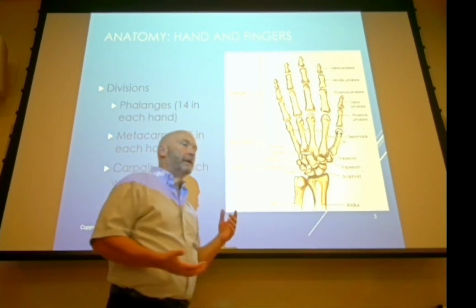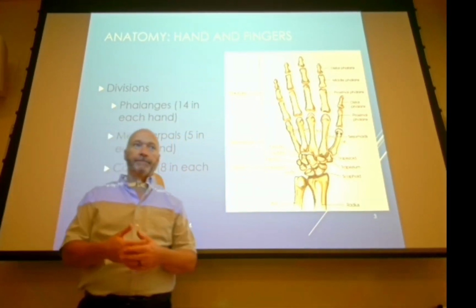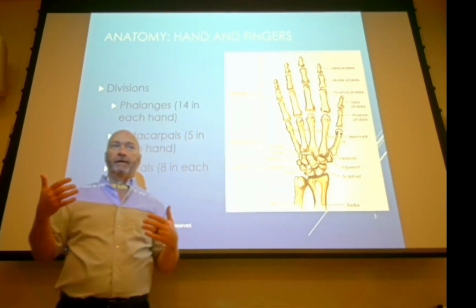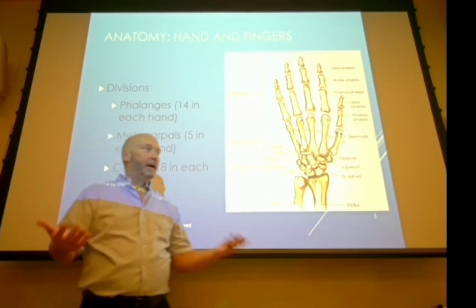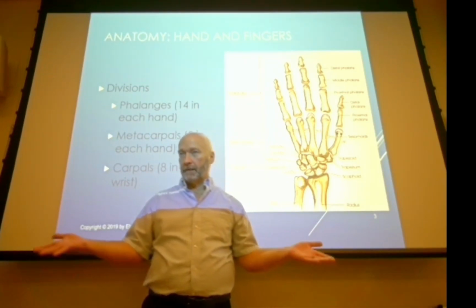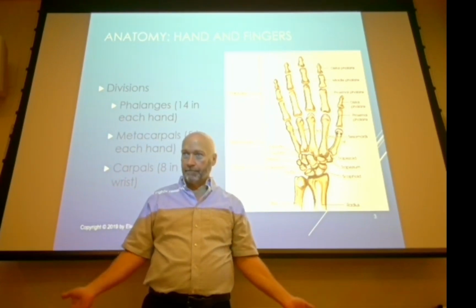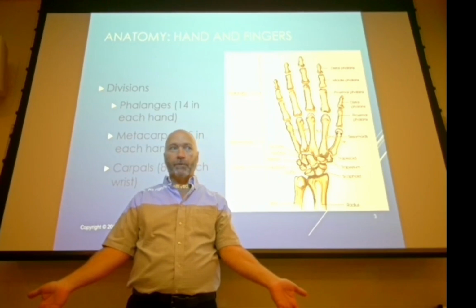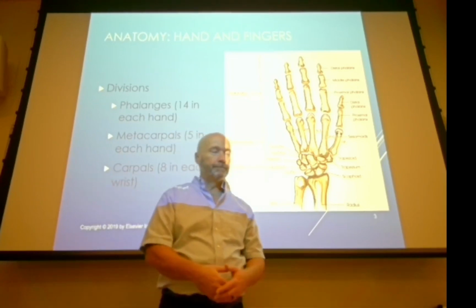All right. So this always goes from anatomical position. When does it go from anatomical position? Always, right? And there's a reason I'm beating on that, and I'll tell you why in a minute. Anatomical position means the patient's upright, hands facing you, essentially supinated, so their palms are facing forward.